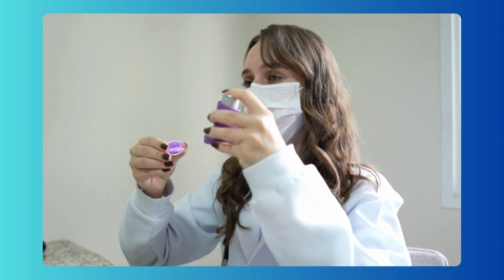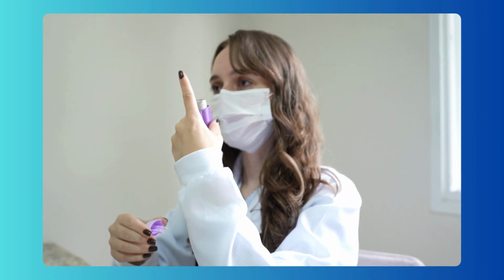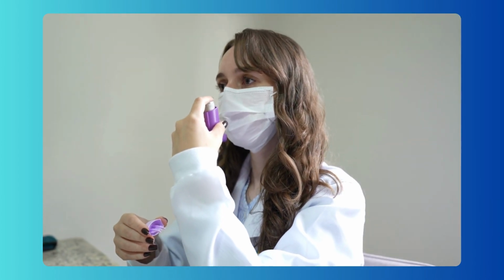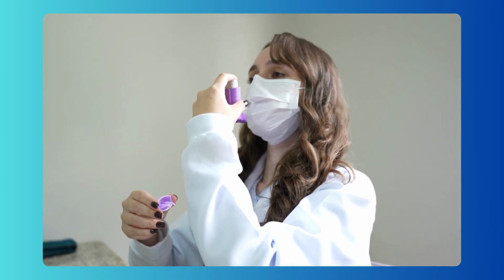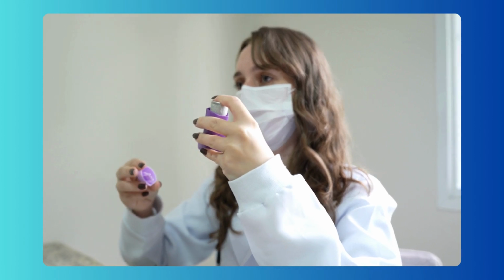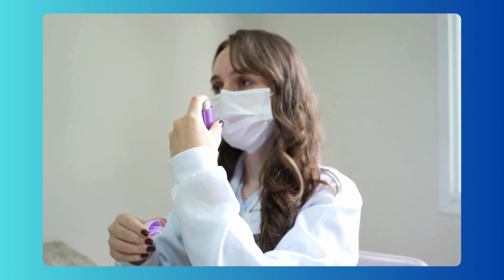Next, assist the resident to a comfortable sitting position. Explain to the resident the medications you will be administering. This is an inhaler prescribed by your doctor to treat asthma. Before I administer your inhaler, do you have any questions or concerns about this medication? No? Great. Let's get started.